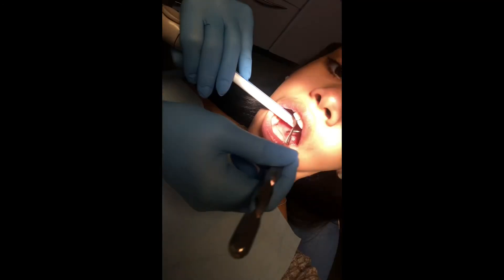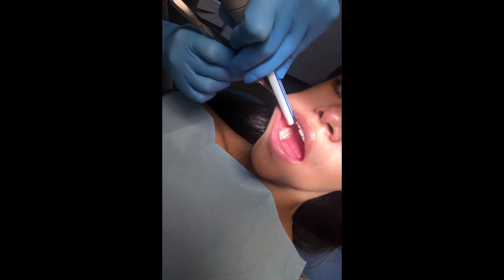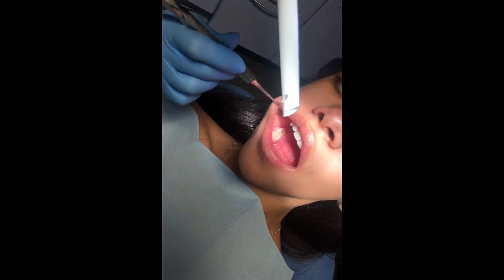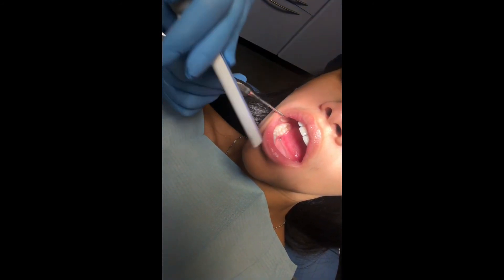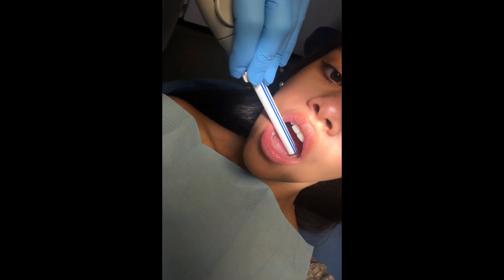If it's a scale and polish and the dentist is going around with his scaler tip, you can just move around with him — go into this side, and again you move around with him. If there's water at the back of the mouth, you go straight in and suck it up. You can go in on an angle and suck the water up here and around.